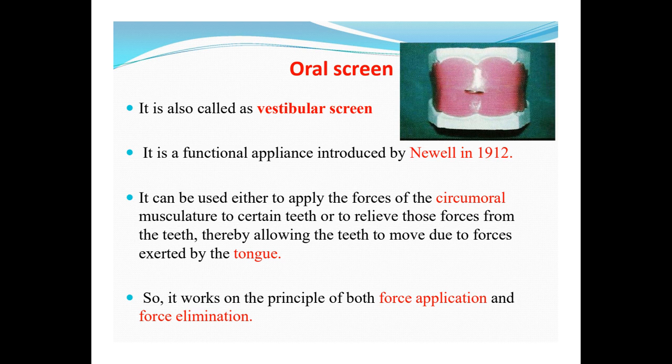So as the oral screen is applied, it causes force application, that means you want the lip muscles to exert more force. Force elimination means you don't want the cheek muscles to act excessively on the side jaws. So it is causing a balance of the forces over the teeth.